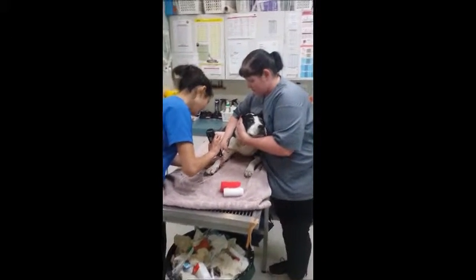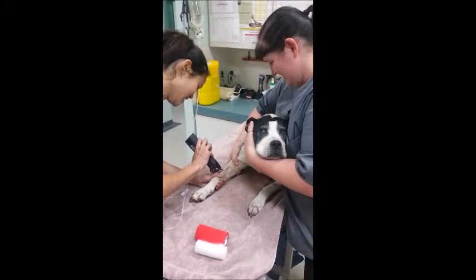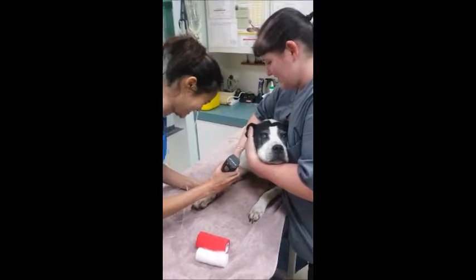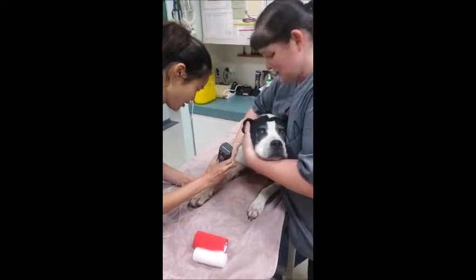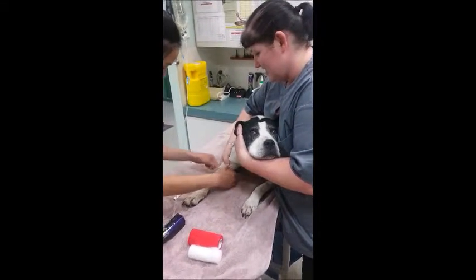The patient is going to be placed on intravenous fluids for the procedure, so I restrain the patient in sternal recumbency on the treatment table. I hold the patient's head against my chest with one hand and with my other hand I hold the foreleg firmly so the veterinarian can begin catheter placement.